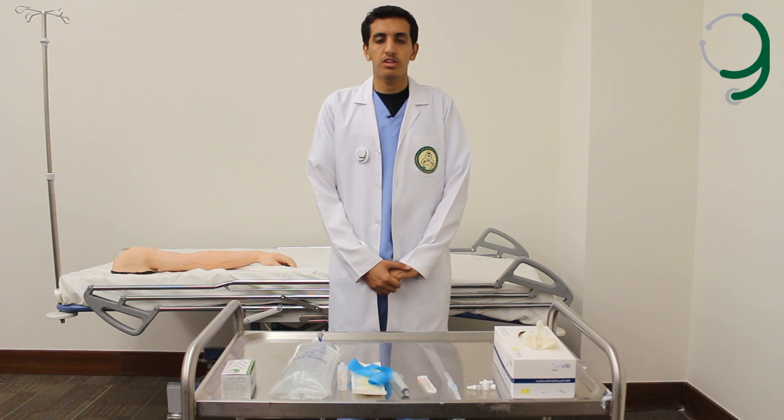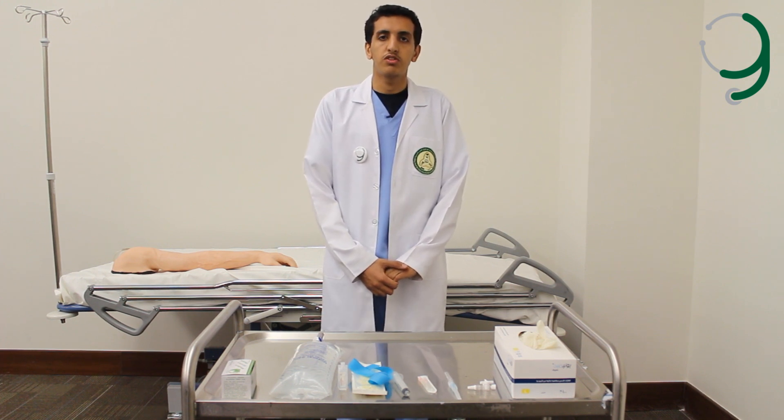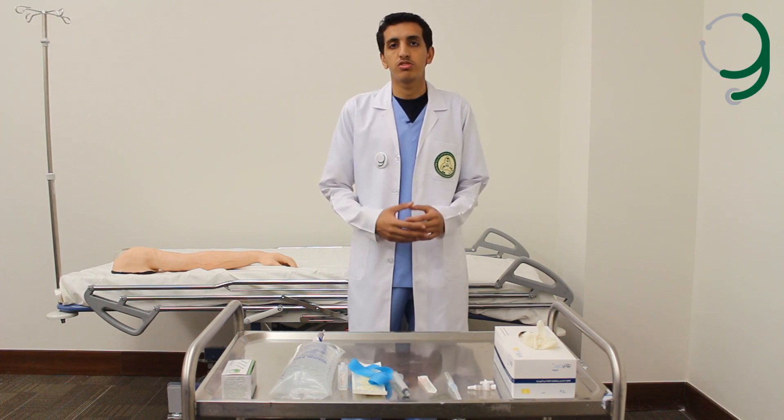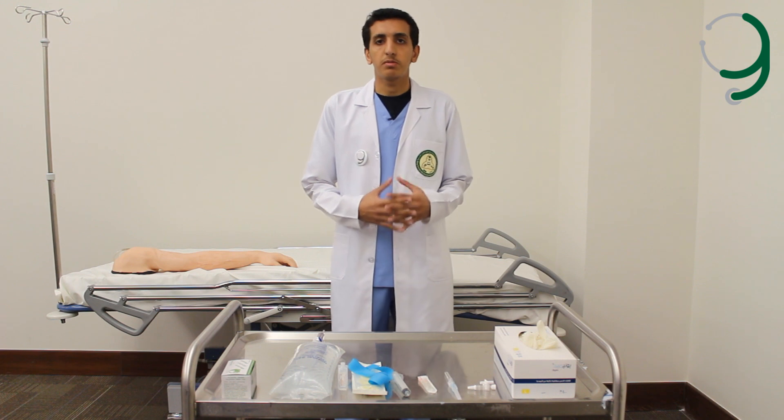As-salamu alaykum, my name is Waleed. I'll be doing today an IV injection infusion cannulation. The first thing you've got to do is to introduce yourself to the patient. You should ask for the patient's name and age. You take permission, you explain the procedure, and you start your procedure.